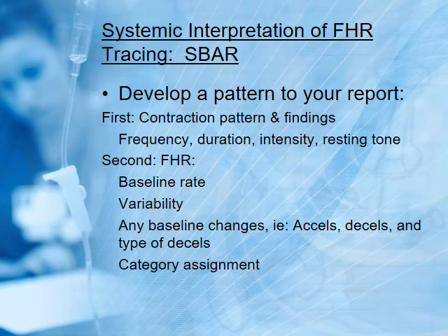And then develop a pattern to your report of your fetal heart rate tracing. If you're calling a physician in the middle of the night, you want to be straightforward and succinct. And we teach you the SBAR, so it's the situation, the background, your assessment, and your recommendation. So first off, I would start with contractions. She's contracting every 2 to 3 minutes. They're adequate. They're lasting about 50 seconds, and she's doing fine. Okay, you don't have to give every minute detail unless there's a problem.